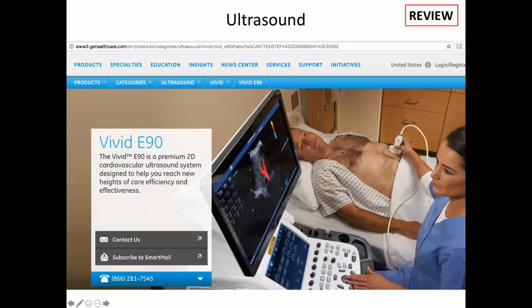Okay. All right, so here's the basic system. They range in price from tens of thousands of dollars to many hundreds of thousands of dollars, depending on the quality and sort of features that you get. This device here is called the transducer, which is held by this person who is a very highly trained, experienced ultrasound tech. And they place the transducer on the patient's body and then image what is underneath the transducer.